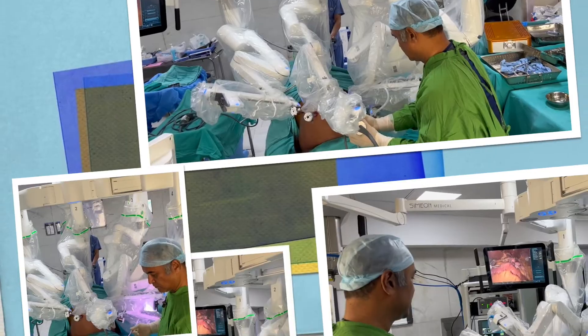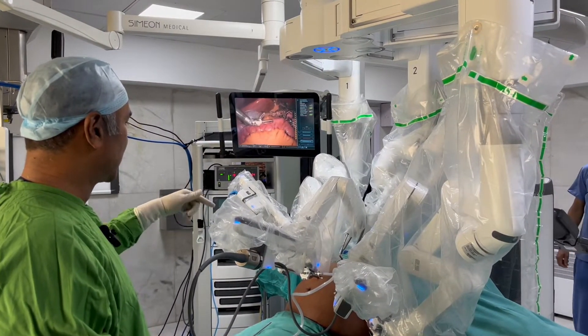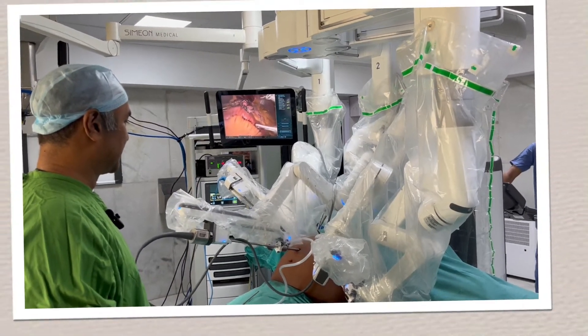Now we can see how the hand movements are being translated into movement of the robotic arms, and the instruments are moving inside the abdomen.